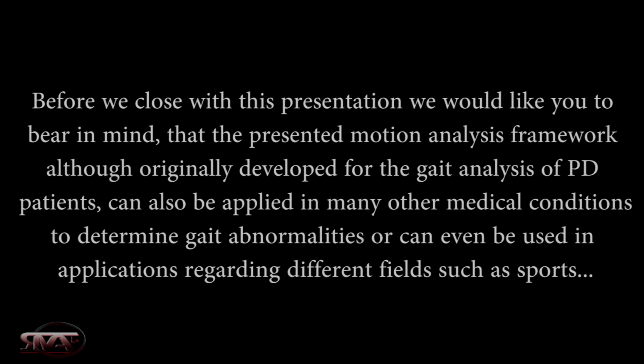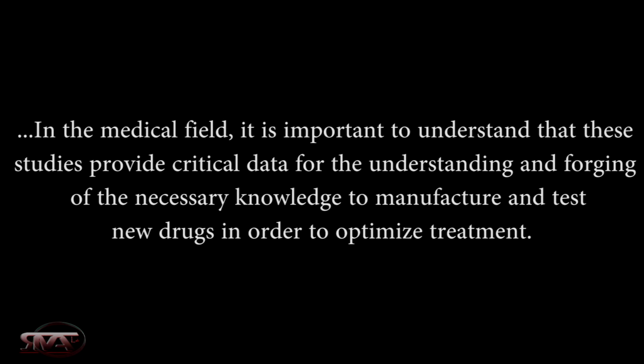Before we close with this presentation, we would like you to bear in mind that the presented motion analysis framework, although originally developed for the gait analysis of Parkinson's disease patients, can also be applied in many other medical conditions to determine gait abnormalities, or can even be used in applications regarding different fields such as sports. In the medical field, it is important to understand that these studies provide critical data for the understanding and forging of the necessary knowledge to manufacture and test new drugs in order to optimize treatment.